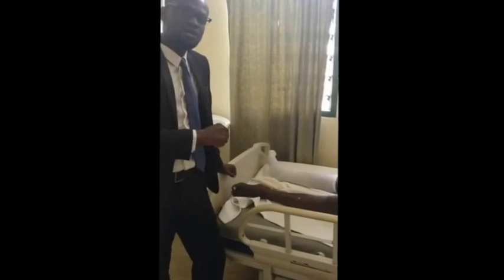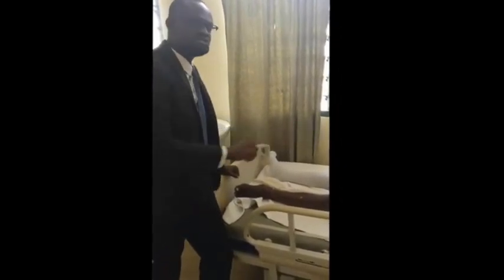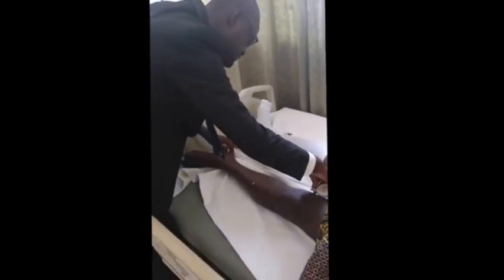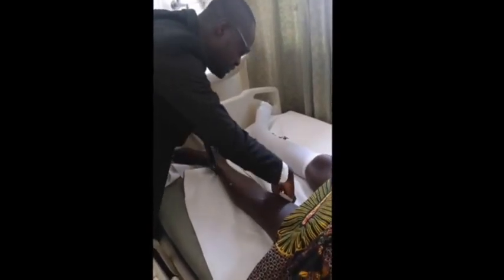So when you want to check the calf diameter, you should make sure the patient's knee is bent. So I'll start by measuring, because we are doing a knee length stocking, from the bend of the knee to the heel. I'll place my measure here. It's the bend of the knee. So to the bend of the knee, it is about 41 centimeters.